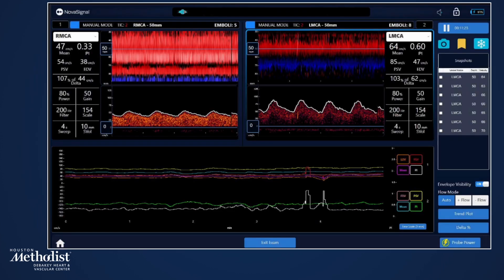Flow velocities are displayed as peak systolic velocity (PSV), diastolic velocity (EDV), and mean flow velocity (MFV). MFV is calculated from PSV and EDV.